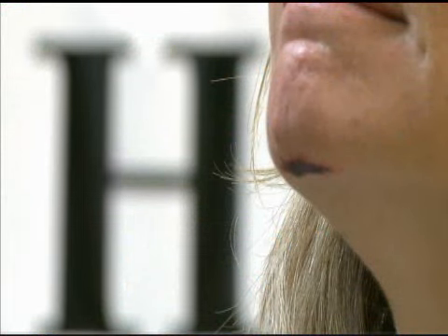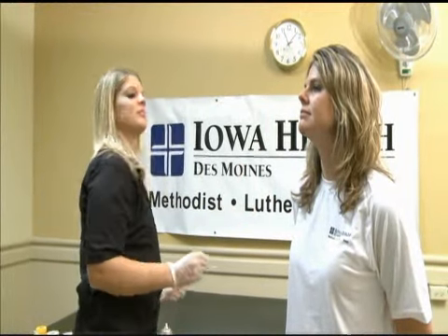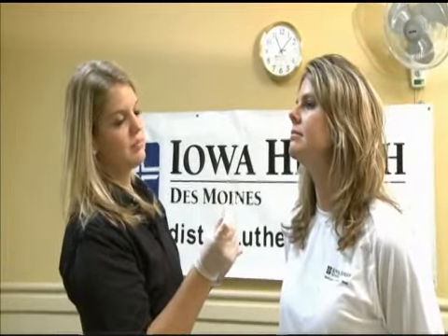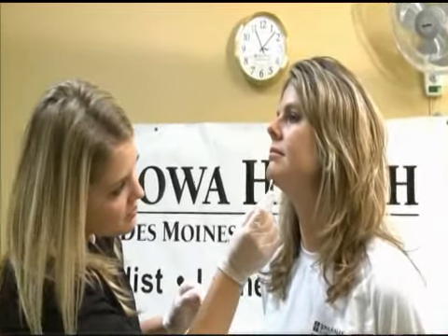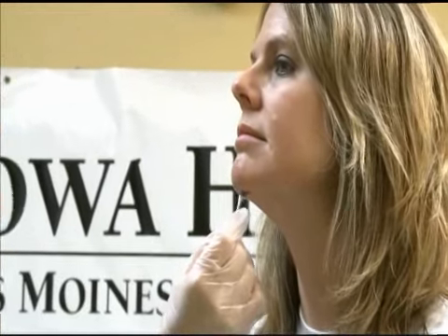Put on rubber gloves. Make sure that the wound is cleaned and no debris is left in the laceration. Spray tape adhesive on a cotton tip applicator. With the cotton tip applicator, spread the adhesive around the wound. Don't let the tape adhesive get into the wound.